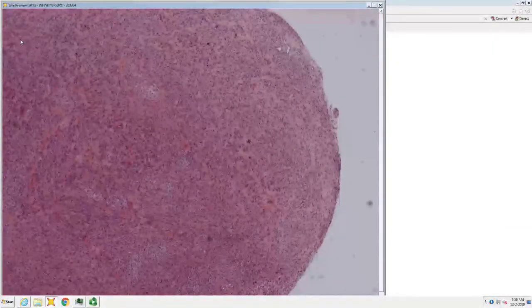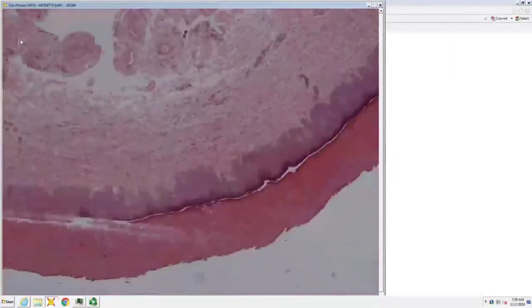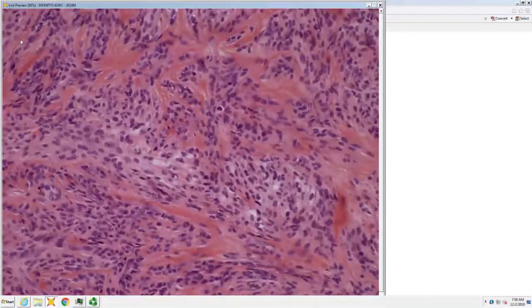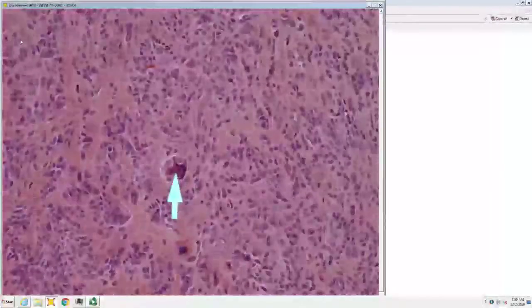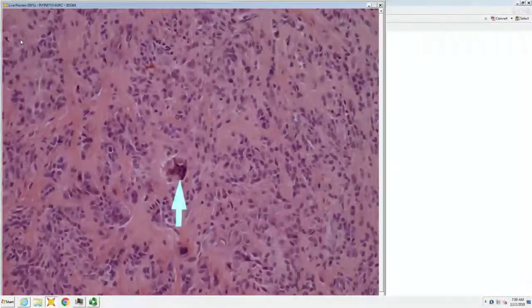Pretty hypercellular. Oh, there's epidermis. Where are you? Acral skin. And the fibroblasts, are they very spindled or are they more plump and oval? Plump and oval. And it's making lots of collagen. Yeah. So it's a round nodule, plump and oval, making lots of collagen, and then you have this kind of giant cell. This is the tendon sheath. So giant cell tumor of tendon sheath.